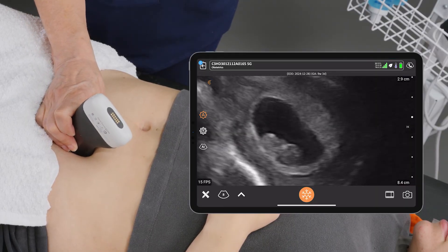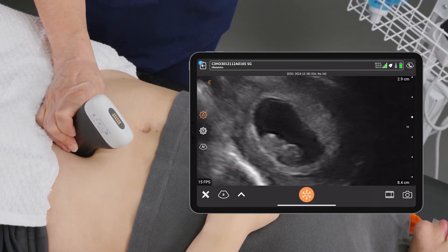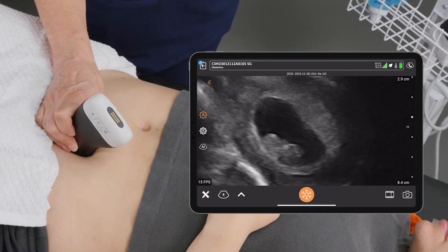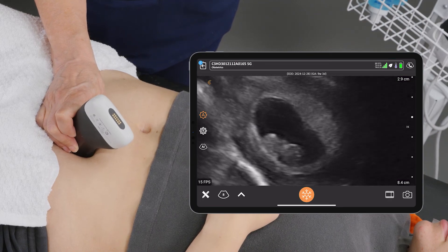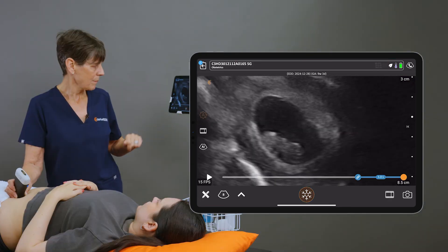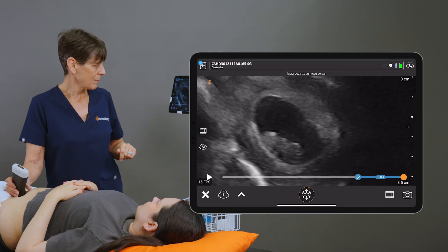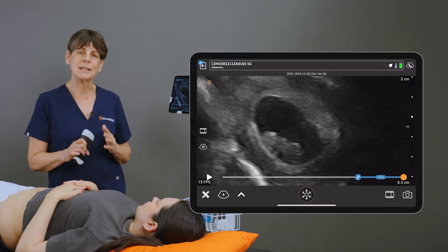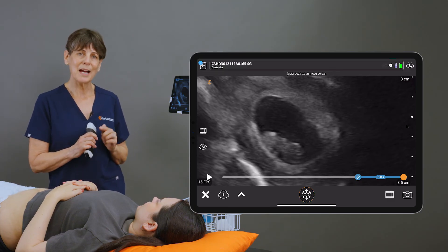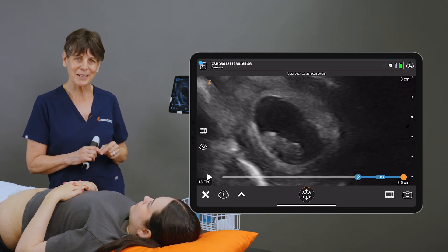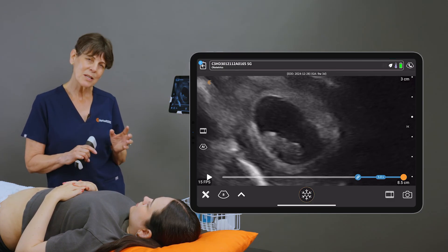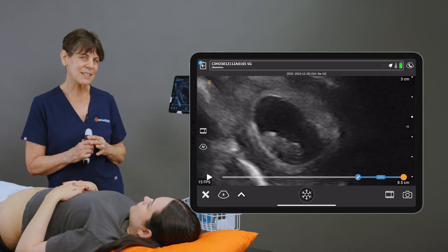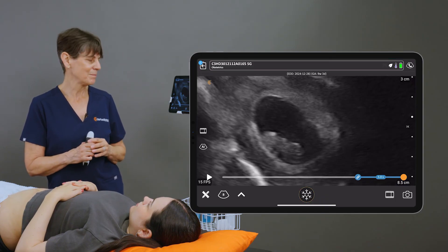Sometimes we're lucky enough to see the amnion as well, but it's getting to the point now we may not see that because it's fused. So now we've established a single live intrauterine pregnancy with a possible corpus luteum cyst on the right ovary, and I didn't see the left ovary.